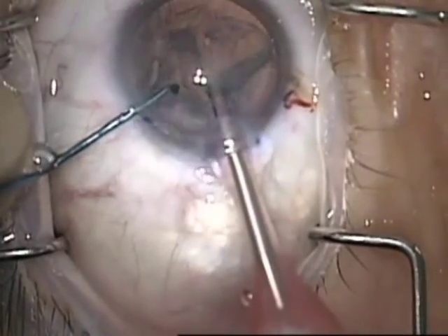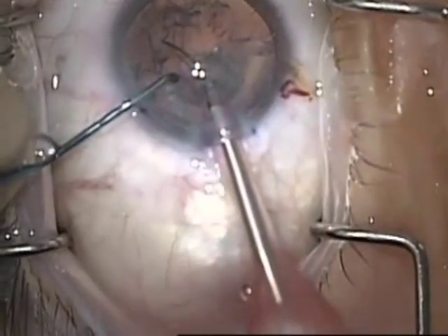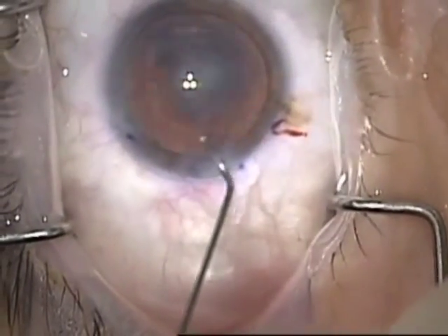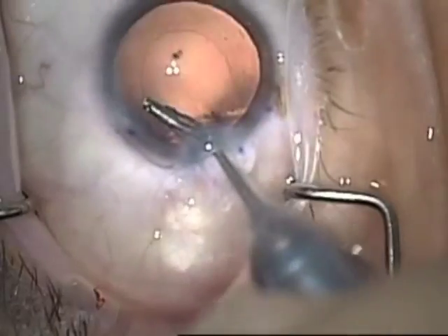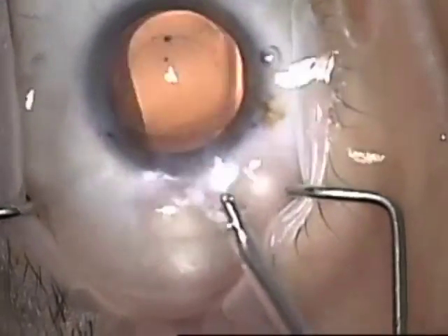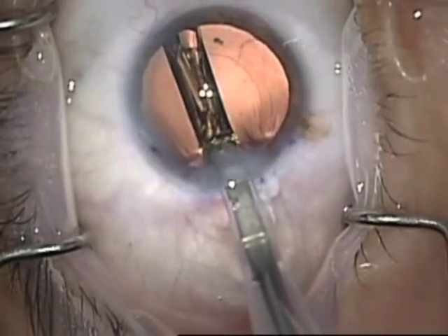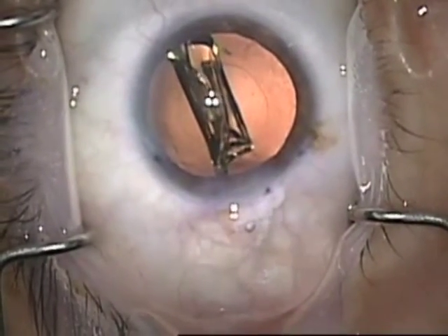Just a small capsulorrhexis to keep the intraocular lens very stable during the DMEK portion. Using bursts of balanced salt solution to remove most of the cortex, then polishing out the rest with irrigation-aspiration, and inserting the lens and dialing it into position.